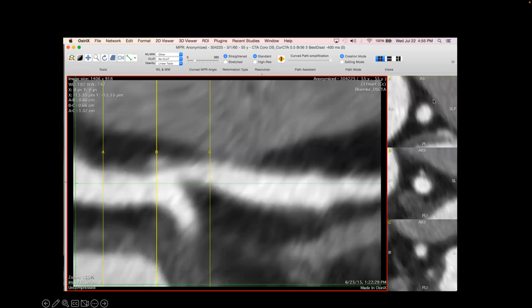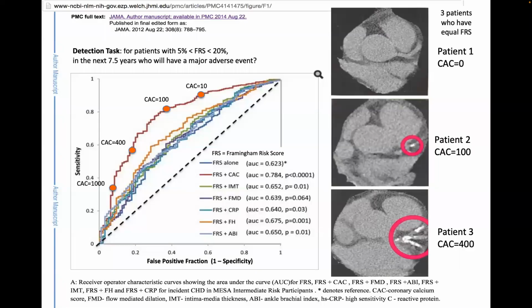And so we looked at this and we said, oh, okay, you can see the proximal diameter of this artery in the fat bed here. You can see the lesion and still the diameter of the artery where the lesion is. And one would say that flow is not going to be perturbed by this lesion, right? Because you've got a wide open artery here. So you're not going to do anything with this person. However, downstream here, there's a little bit of a stenosis.